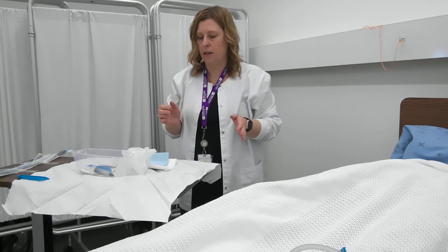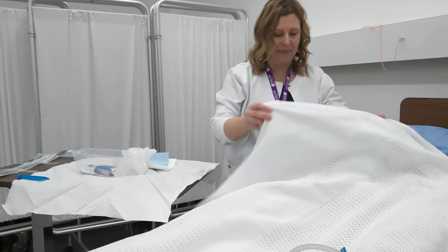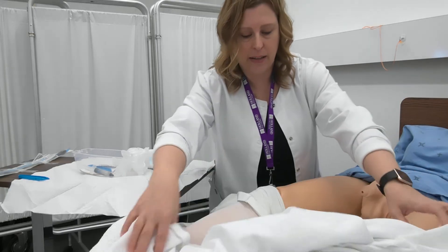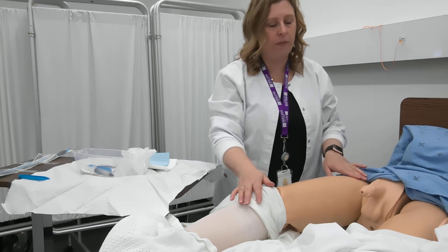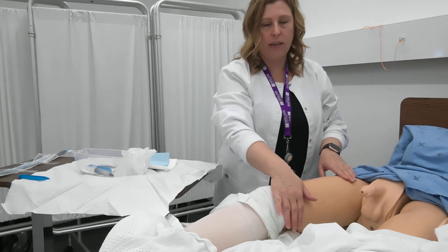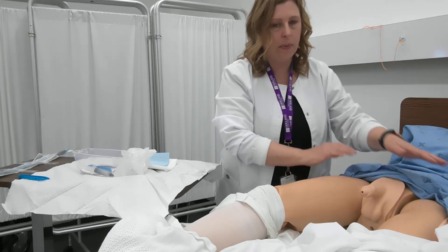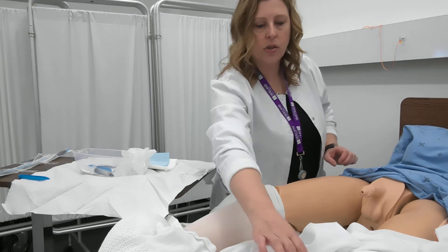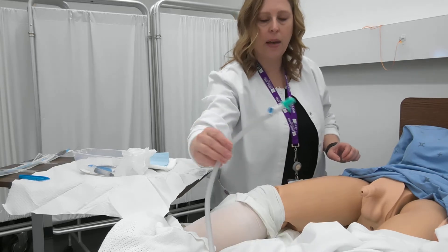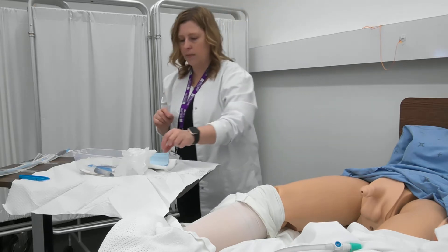Now I can go ahead and put on my sterile gloves — but wait, I need to set up my client first. For your male client, you want to make sure that they are lying flat on their back. Get them to put their legs apart slightly and keep the lower portion of the body exposed. I'm going to make sure that I have my bag close by so I'm ready to connect, and then I can go ahead and put my gloves on.